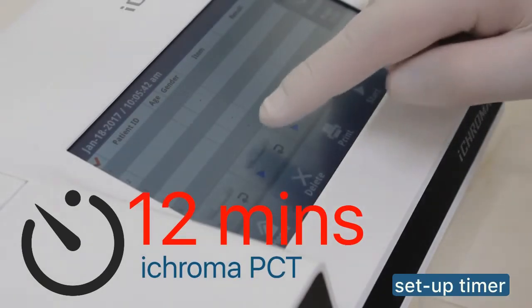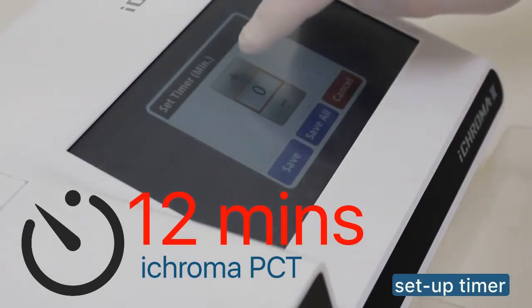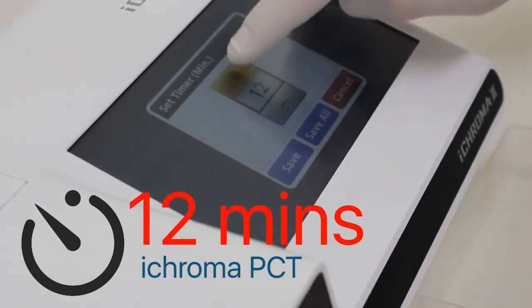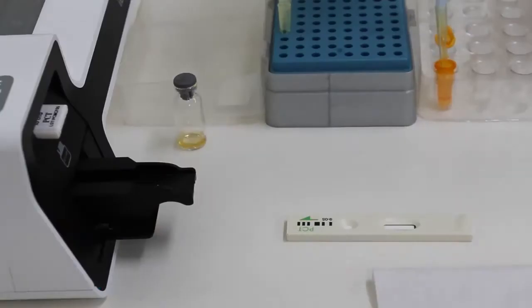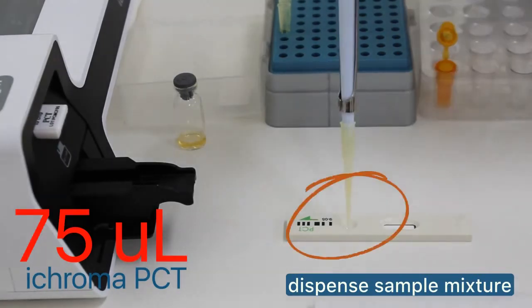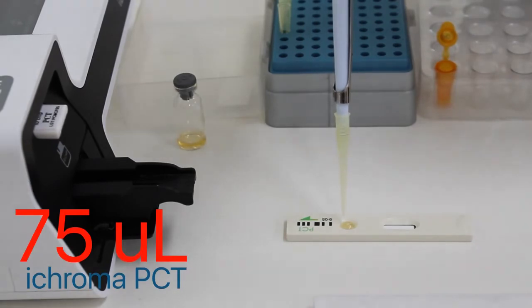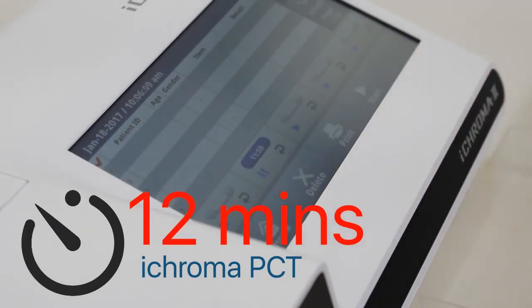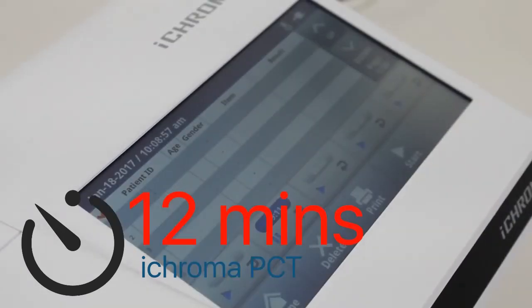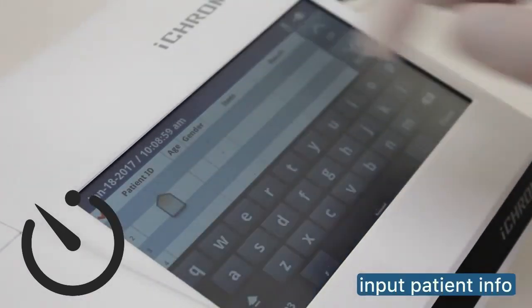Close the lid of the detection buffer tube and mix it by inversion 10 times. Meanwhile, set the timer of iChroma II according to the reaction time of PCT, which is 12 minutes. Pipette out 75 µL of the sample mixture and dispense it into the cartridge sample well. Ensure to start the timer immediately.